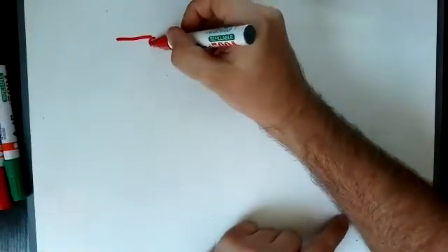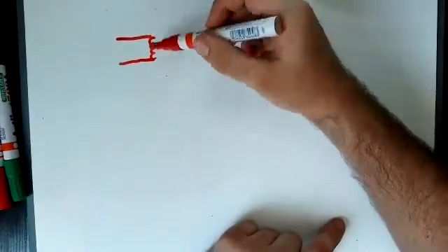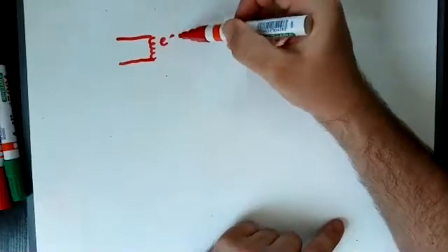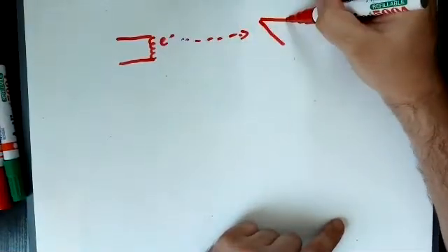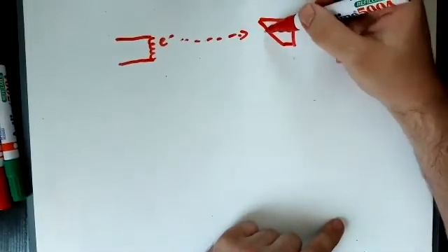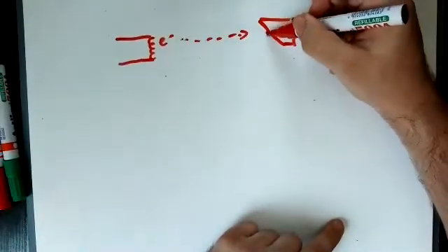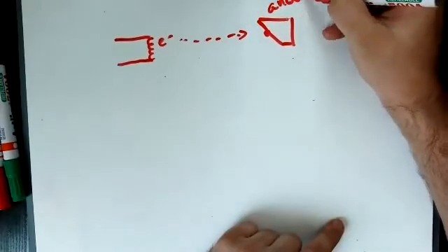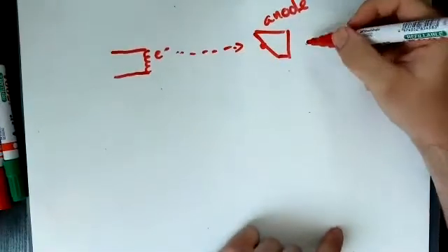A cathode, as you may have seen in an electron tube or something like that, works as a heated filament, from which we then accelerate electrons across a gap. And in the case of the production of X-rays, the electrons are accelerated and caused to strike an anode over here. They strike an anode. Now, the action of striking that anode causes them to slow down.